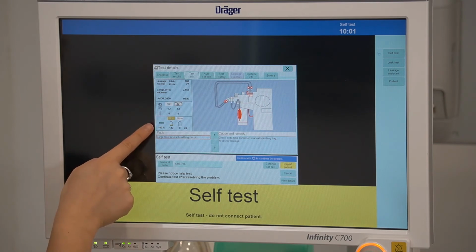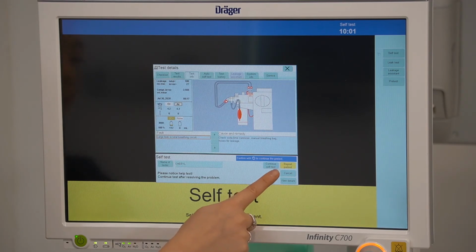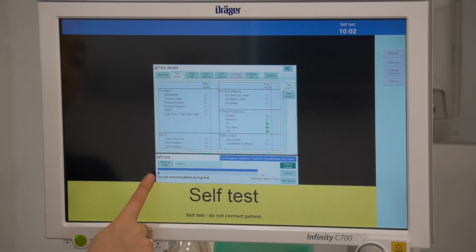With the sample line, ensure that it is appropriately connected, with one end connected to the CO2 water trap and the other end to the machine side of the filter, and the internal sample line connected to the second water trap or the protect water trap. And with your water trap, ensure that it is empty and okay.